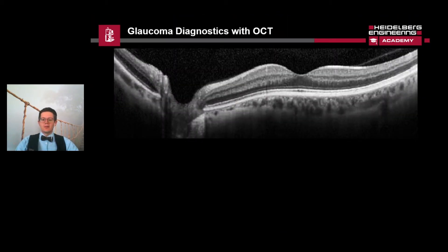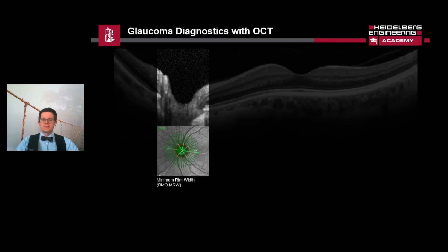First we'll have a look at the different scan patterns and positions. To assess the thickness of the neural retinal rim, 24 radial OCT scans centered on the Bruch's membrane opening are captured, as visualized by the green lines. The minimum distance between Bruch's membrane opening and the internal limiting membrane around the optic nerve head — referred to as Bruch's membrane opening minimum rim width, BMO-MRW — provides the true anatomic optic nerve head boundary and the most geometrically accurate measurement of the neural retinal rim.